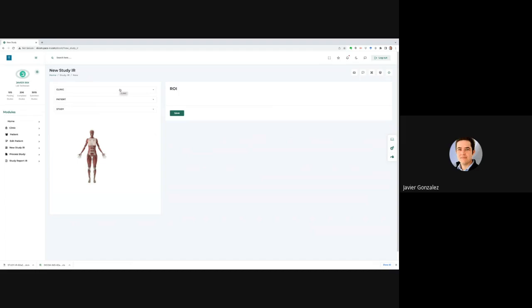So you can see from that nobody's going to spend a lot of time really analyzing the image. They're not going to spend half an hour interpreting an image. No, there's no way, because no doctor is going to want to do that for that kind of money.